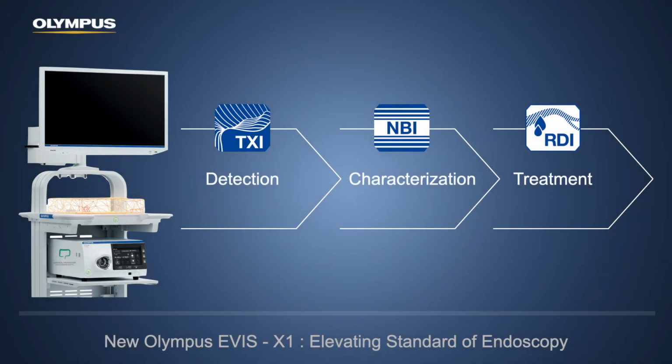This year, a new generation of endoscopic system was released, the Olympus X1, which has this new feature of IEE to elevate the standard of endoscopy. TXI for better detection, brighter and sharper NBI for characterization, RDI for safer therapeutic procedure.